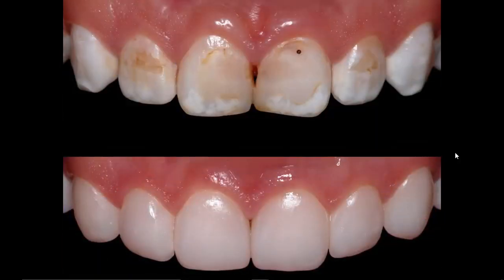I then go in and have the lab fabricate the veneers, and you can see how the veneers themselves are mimicking my diagnostic wax-up. I didn't need to prepare the facial surfaces of the centrals on the mesial facial, or very much preparation on the facial surfaces of the centrals, in order to establish an aesthetic porcelain veneer.